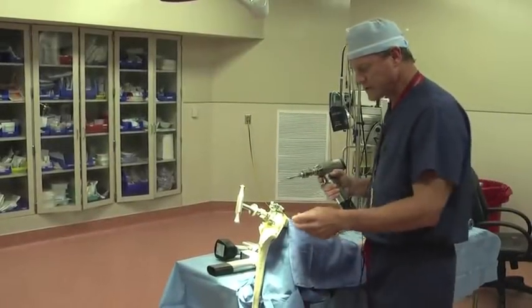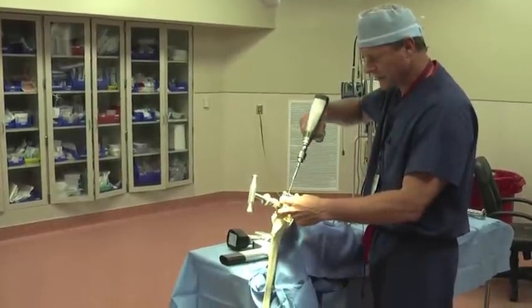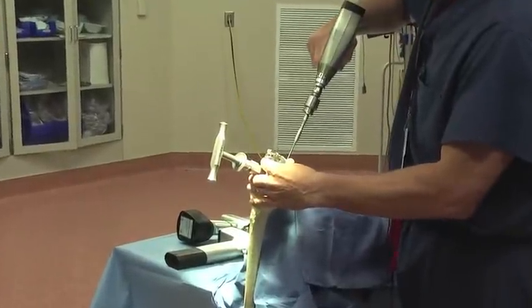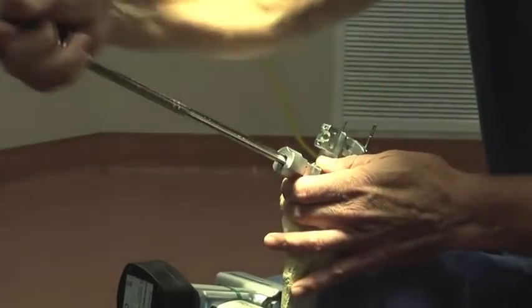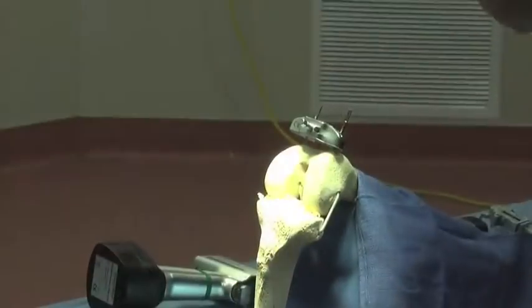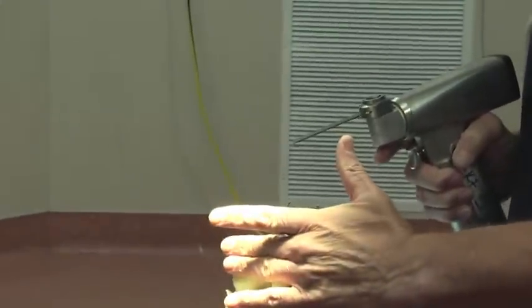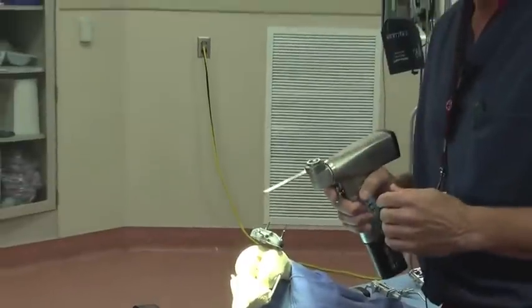Next we'll move over to this side of the table, and we actually will pin this little block into place. We'll place that down and put the second pin in to give it good stability. Next we'll release this and pull the alignment rod off. If we like our distance, we can actually adjust this — so if we don't feel we're getting enough bone off, or we need more bone, or we want to correct the angle, we can do that at this point.